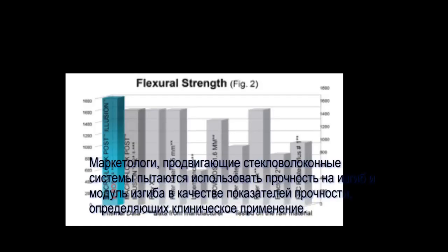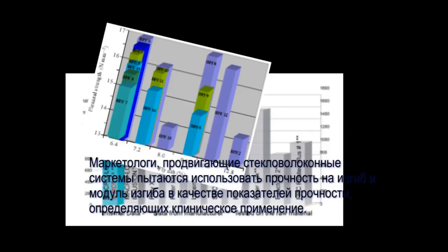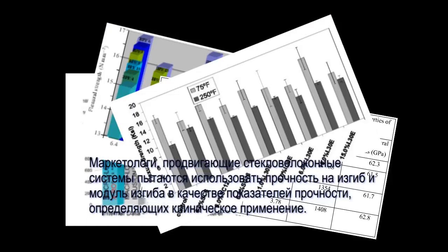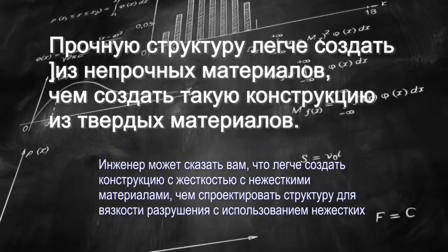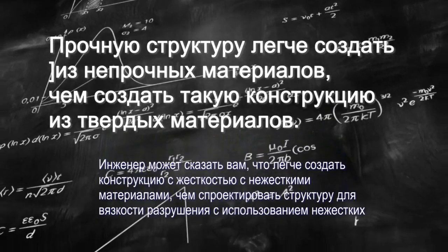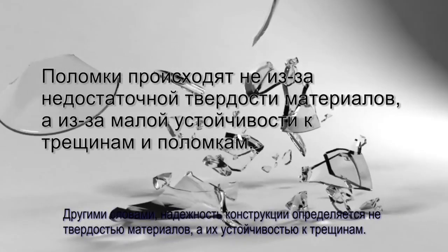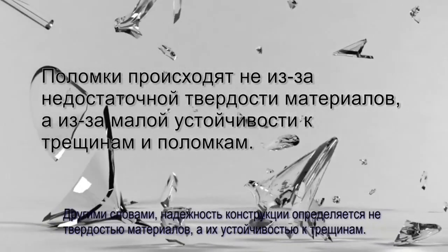Marketers of glass fiber reinforcements sometimes try to use flexural strength and flexural modulus, which are measurements of stiffness, to try to suggest clinical performance. However, any structural engineer will tell you that it is easier to design a structure for stiffness using non-stiff materials than it is to design a structure for fracture toughness using non-fracture tough materials. In other words, structural mode of failure tends to not be due to a lack of stiffness, but rather is due to a lack of fracture toughness.